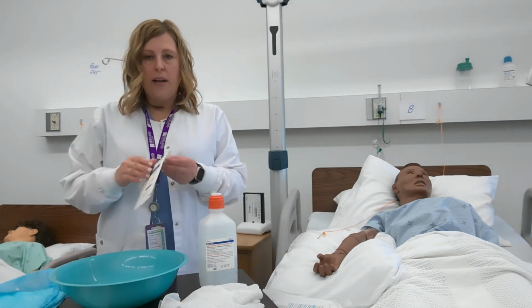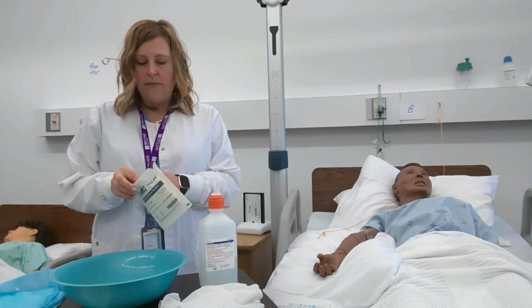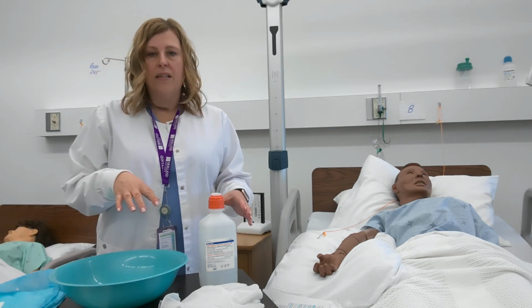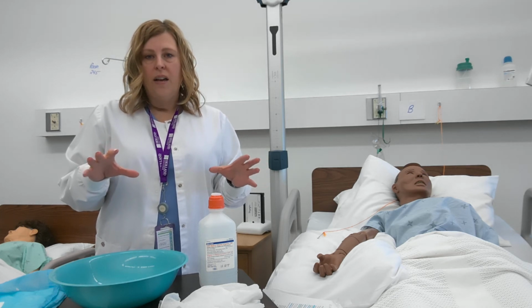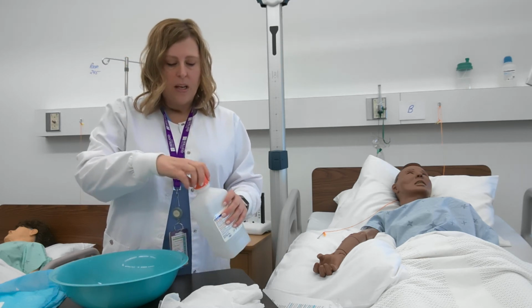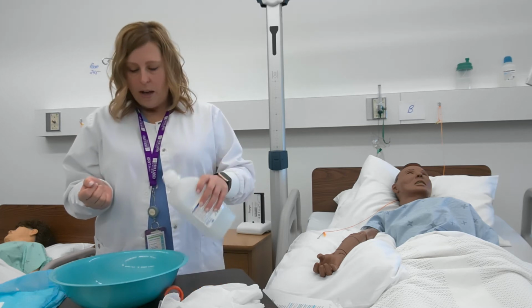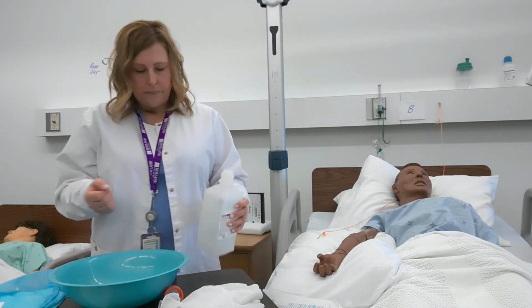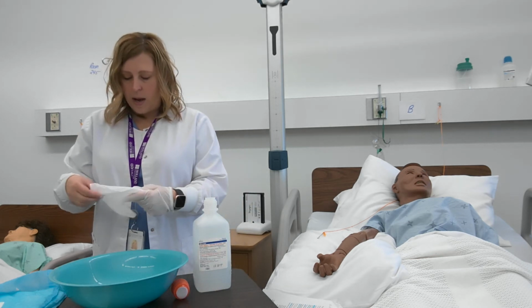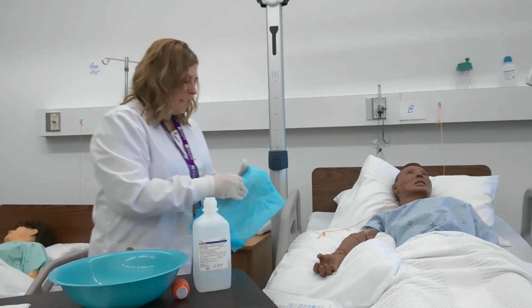Here I'm just going to take my gauze and open it up. You only want to use enough gauze to cover the area in which you want to treat. We don't want to be placing this over too big of a surface area because the heat doesn't need to go there, right? It just needs to go in the area you're treating. I might want to check this on the inside of my wrist just to make sure that it's not too hot. I'm going to put a pair of gloves on just to protect my hands so they don't get wet. My waterproof pad I'll place underneath the client's arm.